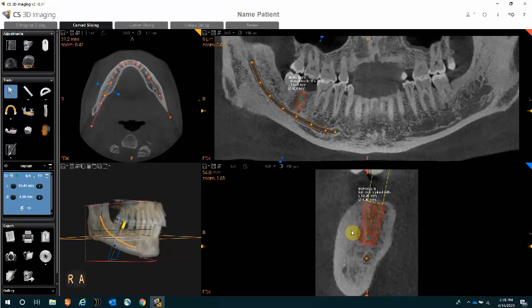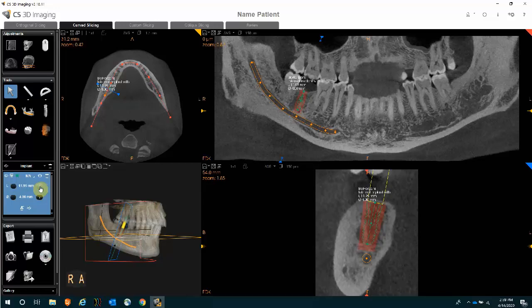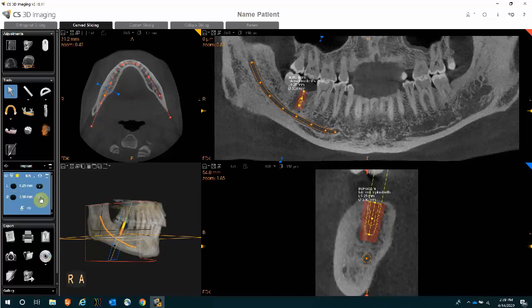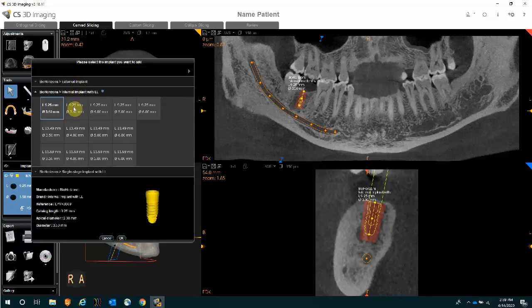Once your implant is placed, if you'd like to try a smaller or larger implant length, on the left-hand side there are plus and minus options for length. Clicking plus gives you the next option up in length; clicking minus reduces the size. You can do the same with the apical diameter. If you're looking to replace the implant altogether with a different brand, there's a replace option — simply click it to select a different size or brand, click OK, and that size or brand will be displayed.